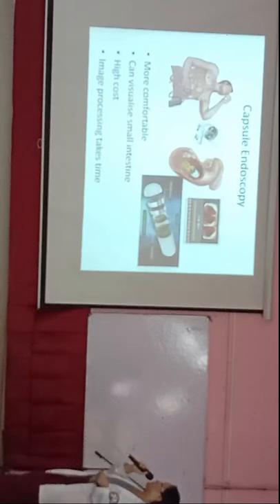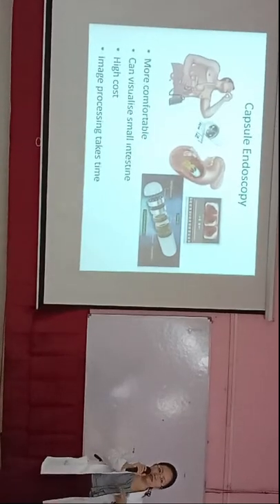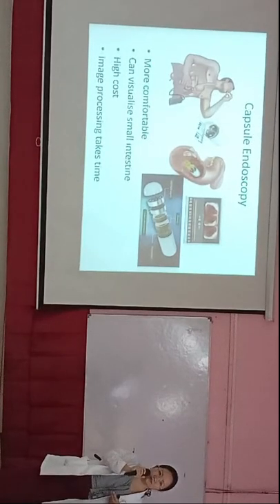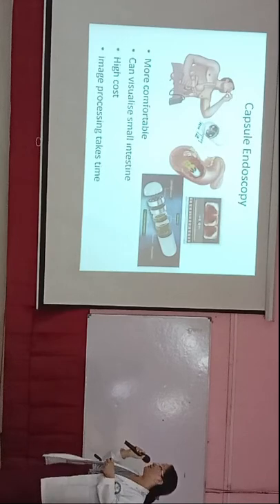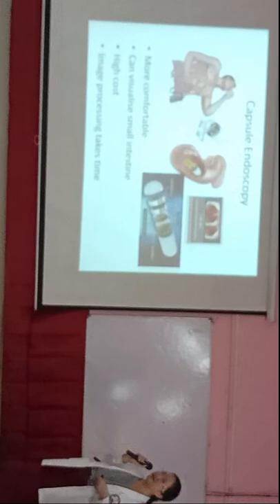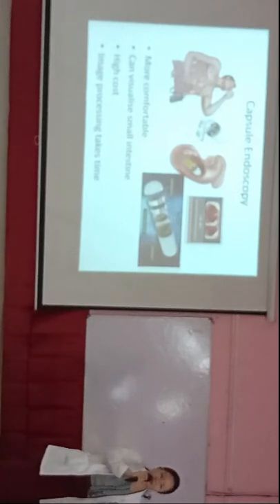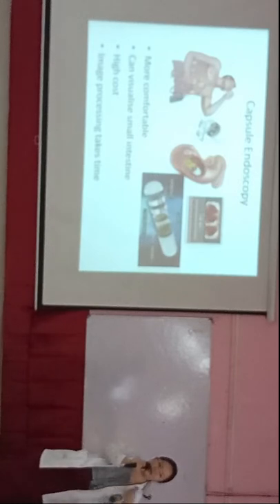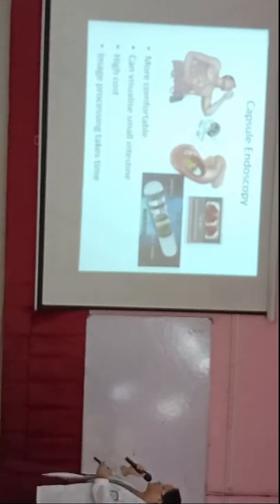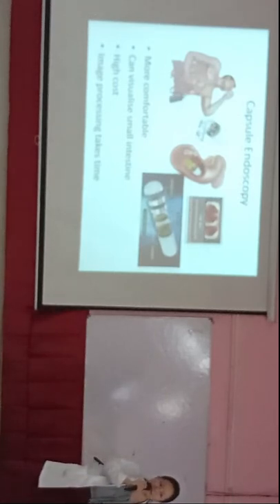But the problem is the cost. The cost is quite high, as of now, around 20 or 25,000. So, it cannot be used in the general population. Image processing takes time. In traditional endoscopy, we get the report immediately. But here, the images have to be processed, a complete report has to be made, so the result cannot be given immediately. Not good for screening purposes.